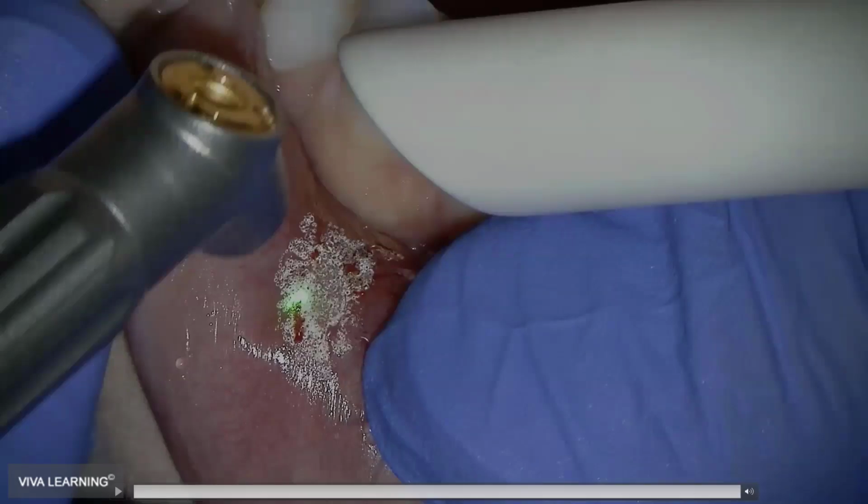If you're doing a class 2 and the patient swallows and you accidentally move part of that beam onto the adjacent tooth surface, as long as you don't hold it there, if it even registers, it's going to look like you had a little phosphoric acid, a little blue etch on that surface, and that's it. Versus if you hold it there, step on the gas, and intentionally cut with great control, you're going to cut very fast. So unless you are not paying attention, it's almost impossible to have any ancillary damage to teeth around it.